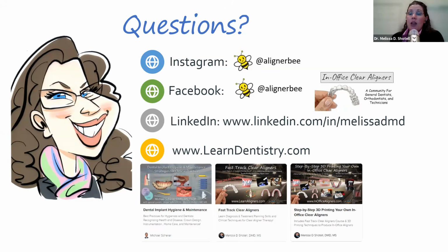I know there are some outstanding printing options available through Blue Sky Bio. If you're interested in automated trimming, I know that there are mill options available through Blue Sky Bio as well. So that's something that I would reach out to Michael here after the webinar and have him point you in those directions, because a lot of times the natural progression is to print, and at first you're vacuum forming and trimming. And then if you're doing a lot of cases, you're going to want to go to automated trimming with milling. So you may want to look at one ecosystem that all works together. So if you're considering going down that road, then that's something that I would reach out to Michael on.